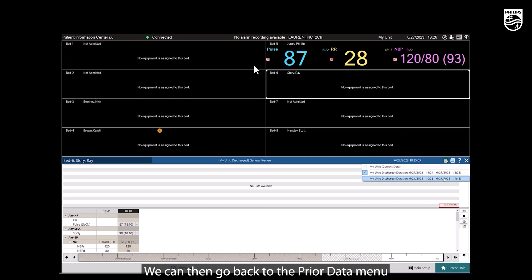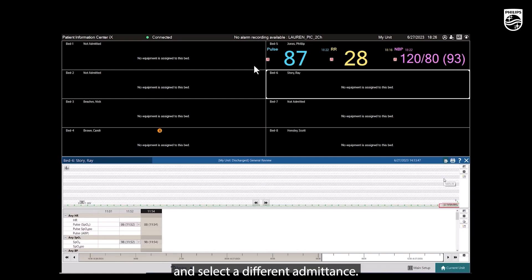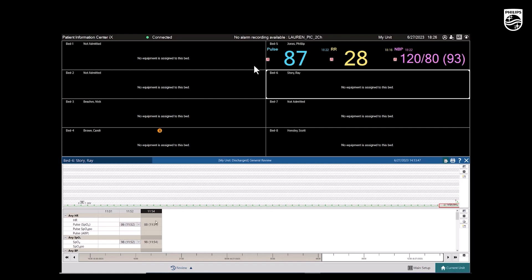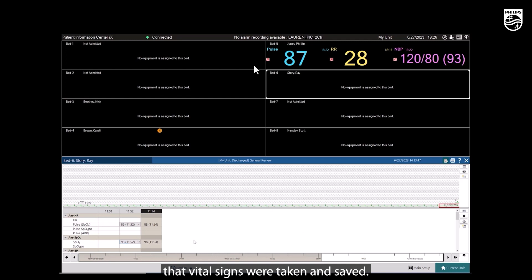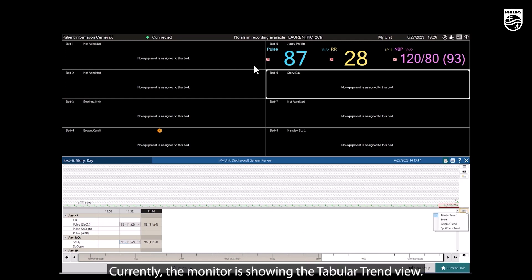We can then go back to the Prior Data menu and select a different admittance. You can see that each row represents a different time that vital signs were taken and saved. Currently, the monitor is showing the Tabular Trend view.